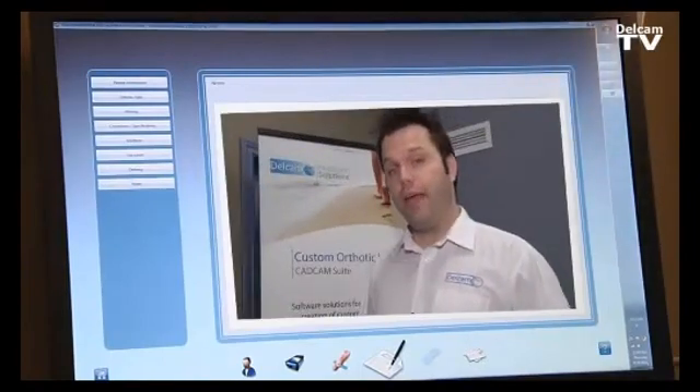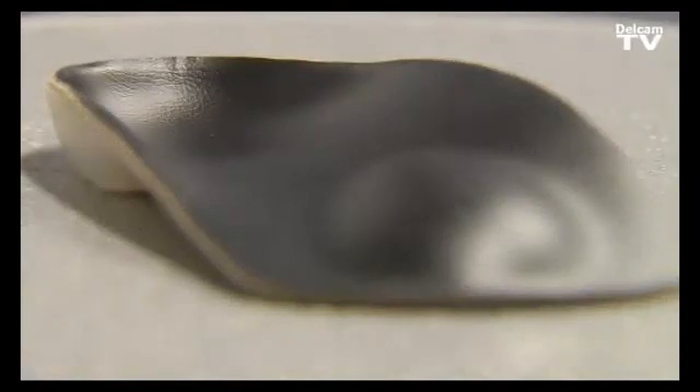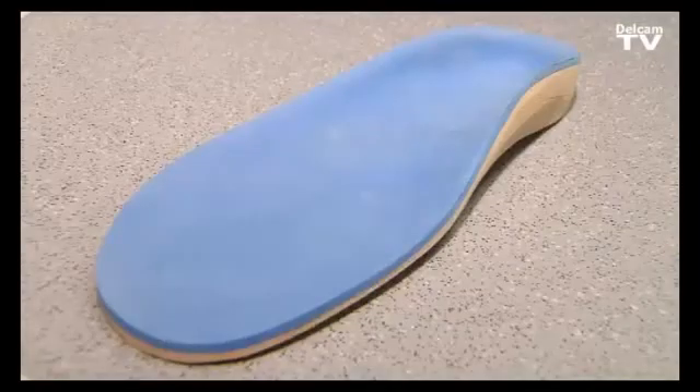The next step uses OrthoManager, where the practitioner or doctor can send all this information to the lab — including the 3D shape of the patient's foot, the picture, and the prescription. No longer do we have to mail a crush box or casts; everything is sent by email and the lab can automatically start manufacturing the orthotic.